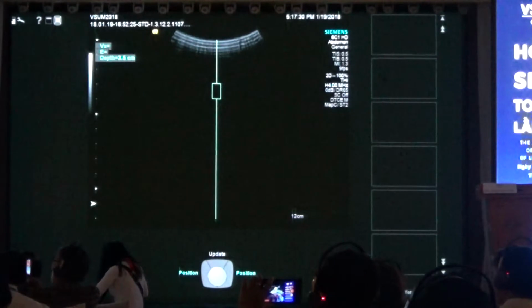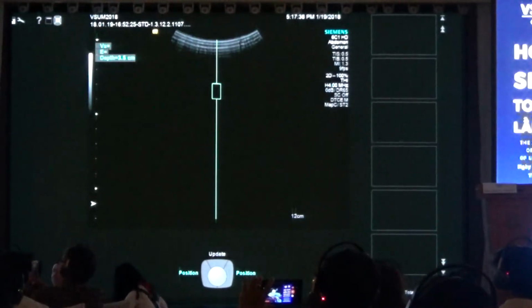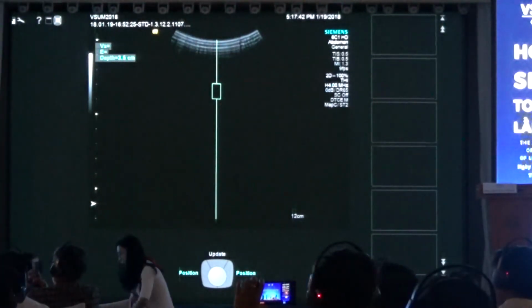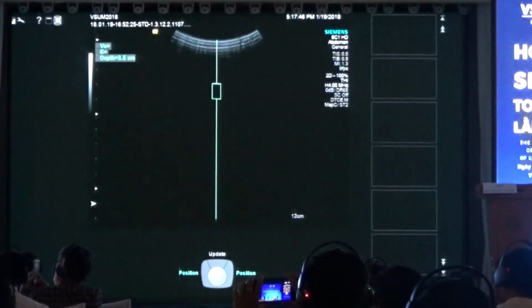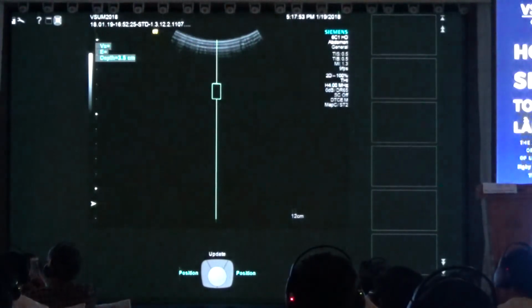He takes a breath because he does not know what I'm doing. So I anticipate, not to tell him do not breathe, because almost all people take a little breath on that. I'm anticipating what he's going to do, take a little breath. Okay? So that's a way to handle the patient and the people.